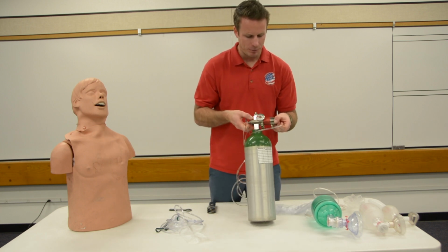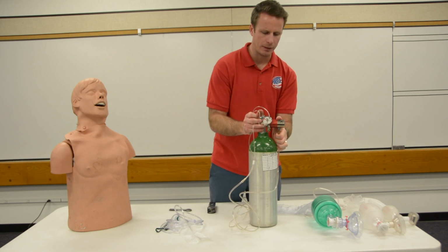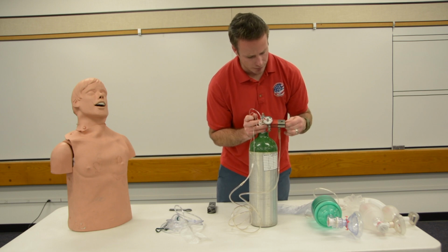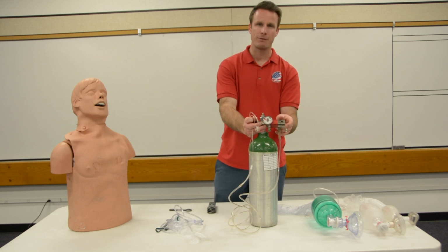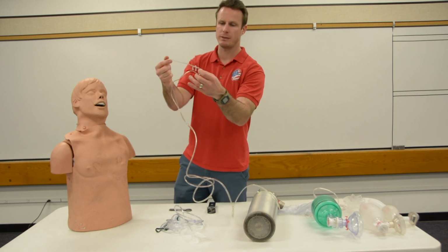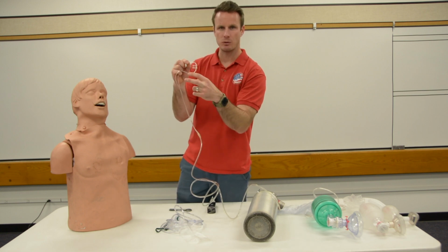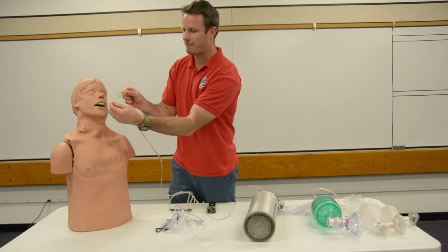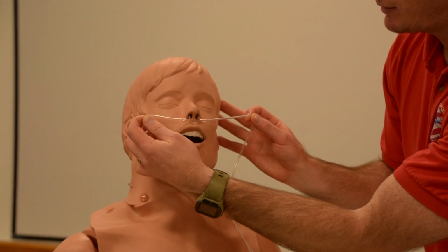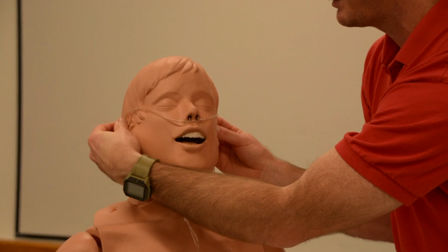So I'm going to stand my tank up, I'm going to connect my nasal cannula directly to this port right here. And I'm going to select 4 liters per minute, since that's halfway between 2 and 6. I got on 4 liters per minute. Now I'm able to administer it or put it on my patient's face. I want to take my nasal cannula and I want these prongs, you can see they have a little bit of a curve to them, to be inserted in my patient's nose and kind of follow the pathway of their nasal cavity. So it's going to go inside their nose, all the way up. It's going to go around their ears just like this, as best we can with this guy who has no ears.